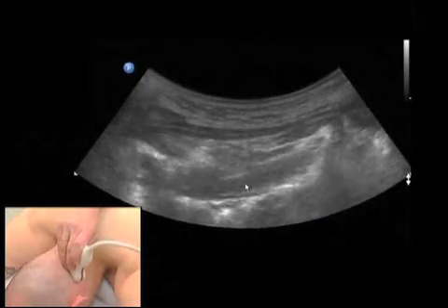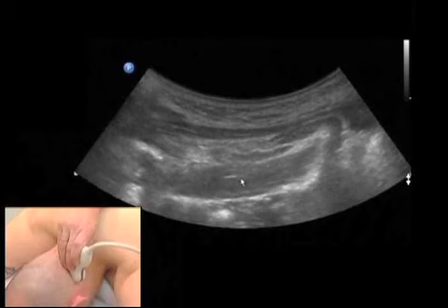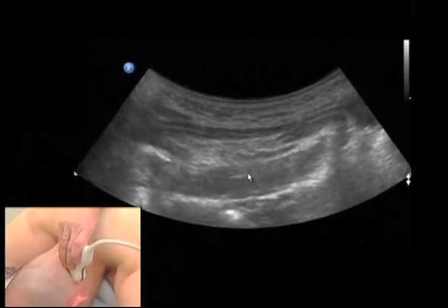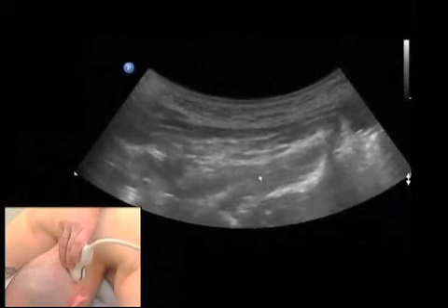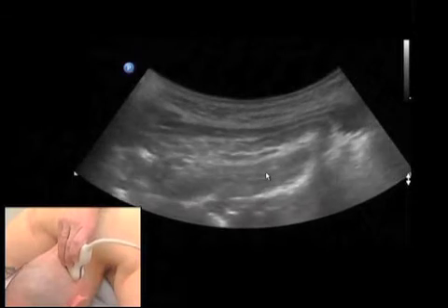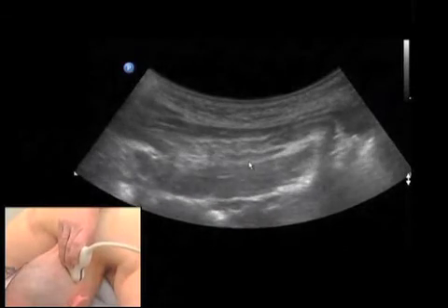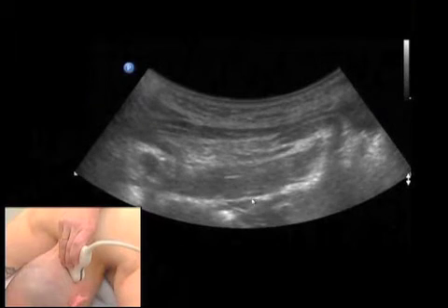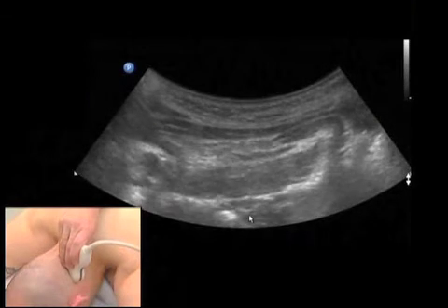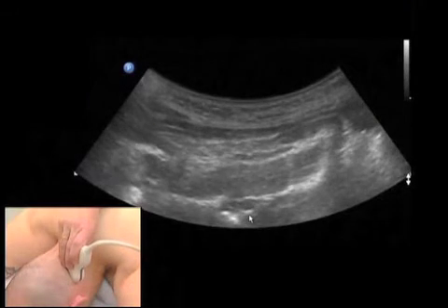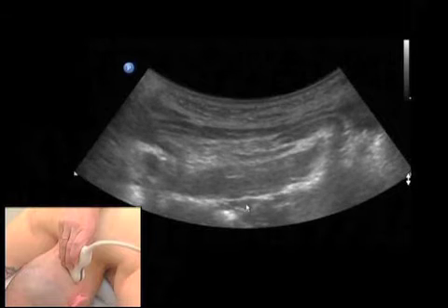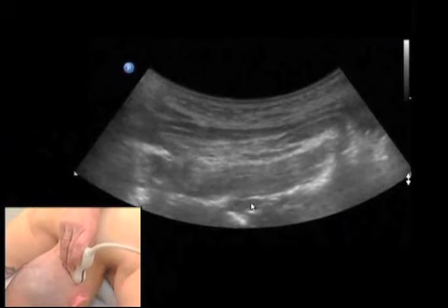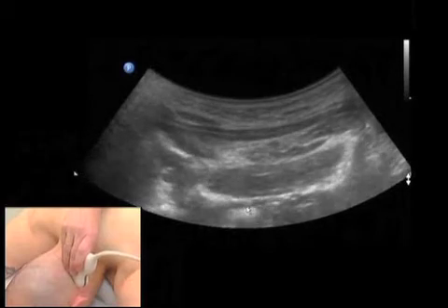Despite the fact that you have a low-frequency transducer, you will see that the greater occipital nerve may be visualized on top of the obliquus capitis inferior muscle. And in this individual, you also see the second dorsal root ganglion, which is in front of the obliquus capitis inferior muscle.